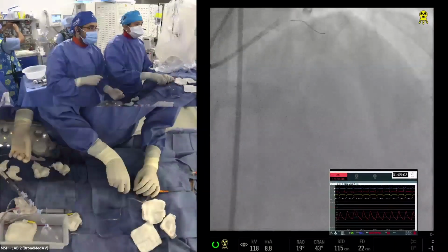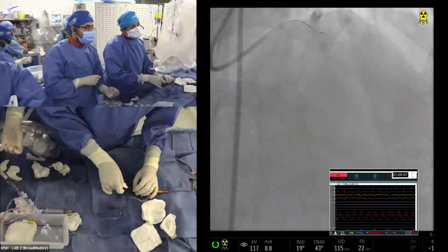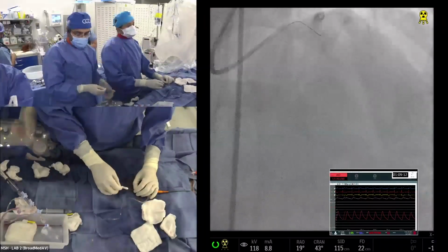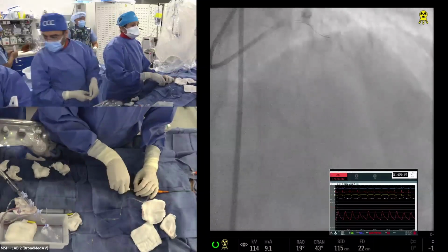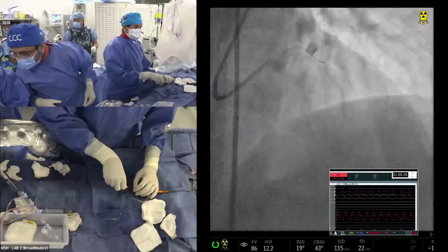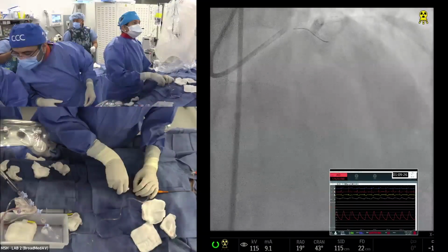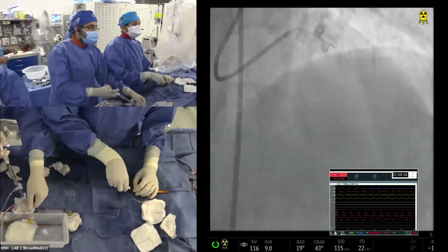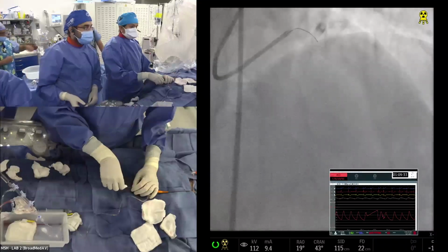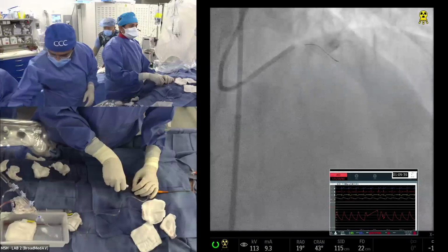Our concern is pulling out the wire from a vessel that has undergone atherectomy and a cutting balloon. You lose access if you have to burr the side branch. So that is always the concern. And of course, if that is the issue, then we have to see what we can do. We have to optimize, and whether the cutting balloon is going to cause a dissection is the issue. But as I said, in this case a little bit of dissection is expected, but nothing significant happened.